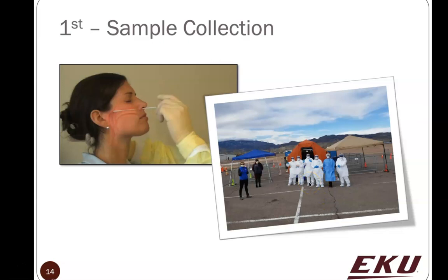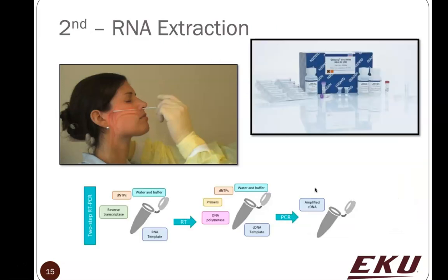And they are inclusive of nurses and also potentially doctors, but most health departments have public health nurses that are able to actually take these kinds of samples. So they're doing drive-through sampling. Now, like the drive-through sampling, or if you were in the clinic with some symptoms and it warranted you actually getting a test done, what would happen to that swab?